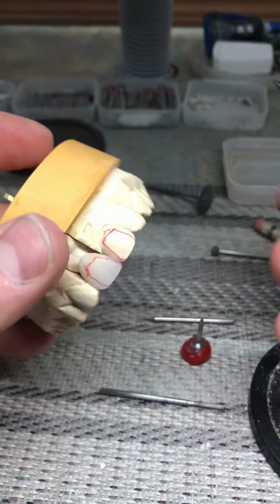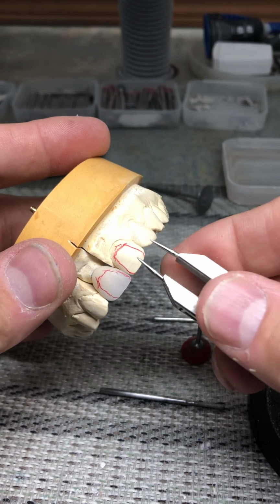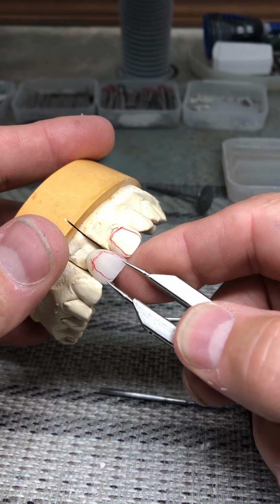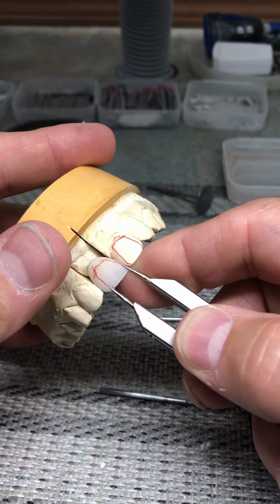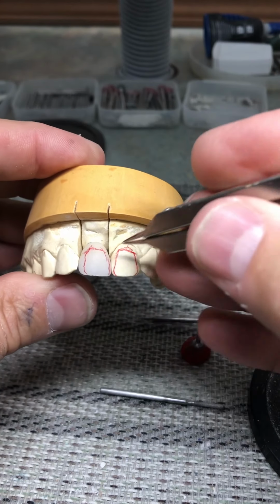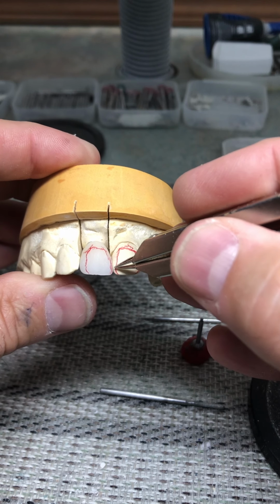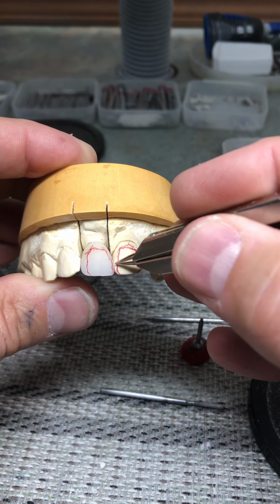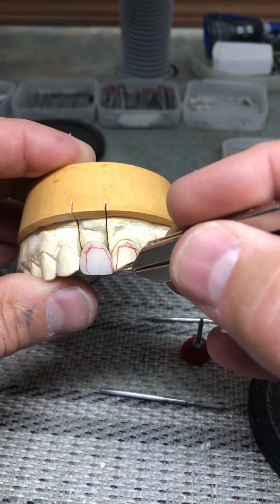Minor adjustment. Then we can measure the apparent width of number 9, the apparent width of number 8. I'm pretty close, but we have to make sure we maintain that as we adjust this tapering surface on this contour.